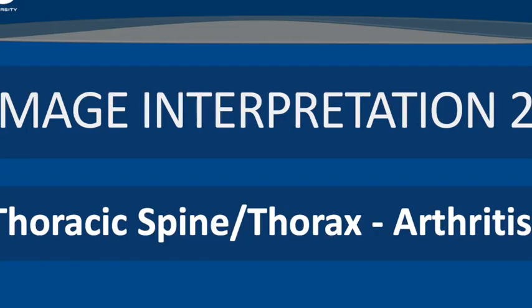Welcome everyone to today's presentation on thoracic spine and thoracic cage arthritis. We'll dive into the radiographic findings, clinical presentations, and key distinguishing features of various arthritic conditions affecting this region of the body. Get ready to expand your differential diagnosis skills.